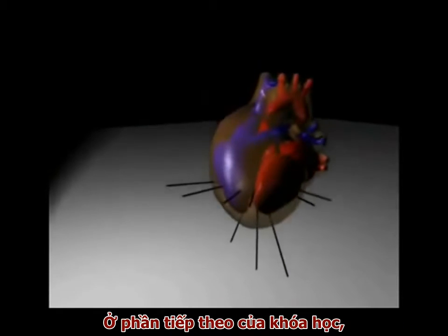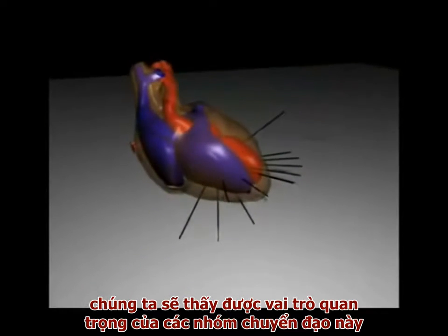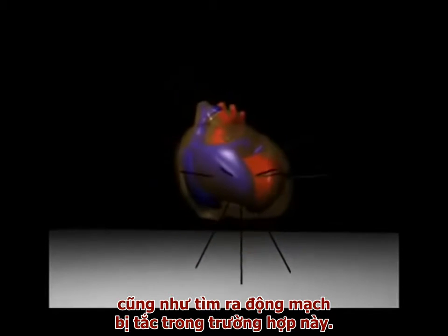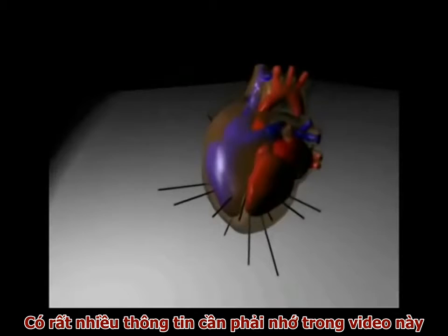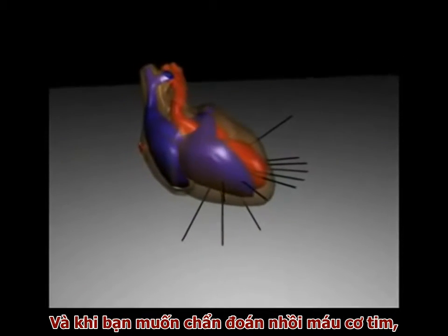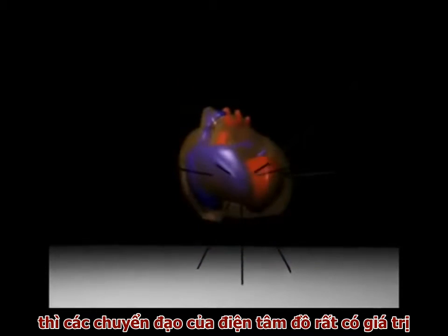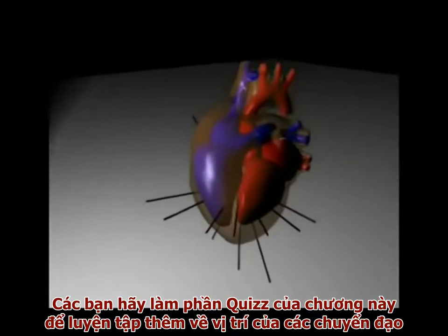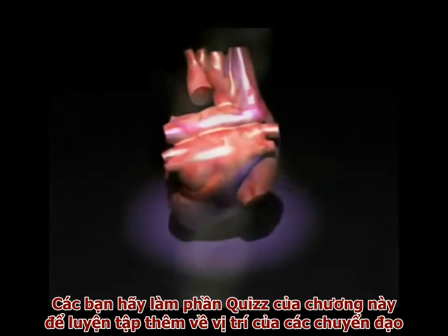In a subsequent section of this course, we'll see the key role these groupings of leads play in diagnosing myocardial infarction and in identifying the vessel obstructed in this condition. There is a lot to try and remember in this video, but as you'll see when we go on to diagnose heart attacks and serious pathology, the perspective of the individual leads on cardiac electrical activity is well worth knowing. We will try and reinforce your knowledge of lead positions in the test material at the end of this section.